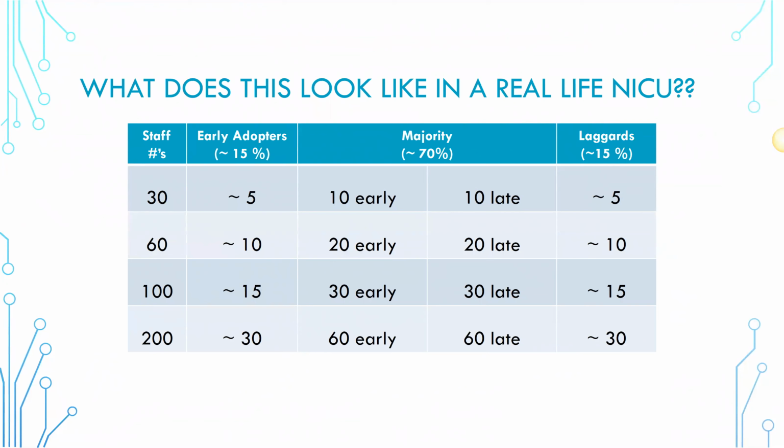Then to interpret, all we do is look at the thickest part of the upper margin and the lower margin, and we look for the trend over time. For a healthy, normal term aEEG, we want that upper margin to be greater than 10, and we want our lower margin to be greater than 5, except when the baby's having a discontinuous trace for sleeping.